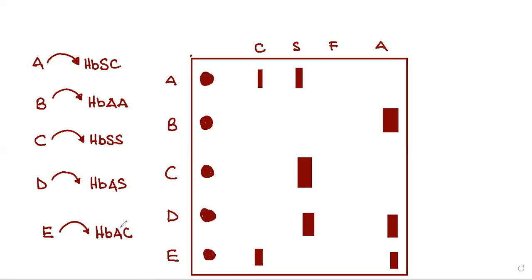So now I come to you, Ofosua. Identify the patients with sickle cell disease. Okay, patient C, patient D. No, D doesn't have it. Patient A and patient C. Patient A and C are those with sickle cell disease.